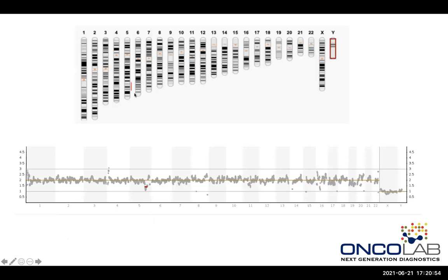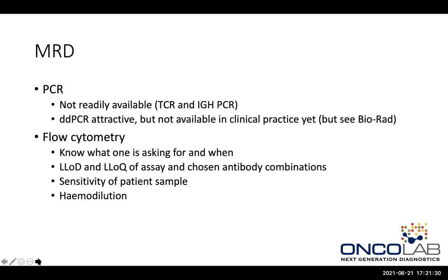So this was a patient we knew with an isolated 5q minus, and you can see that it picked that up successfully. But this patient had about, I think, 60% positivity on FISH, so it was easy to pick up. Had that patient had only a 5 or a 10% positivity, as you can see on this scatter plot at the bottom, it would have gotten lost in the background noise. So we've kind of abandoned this for the time being. It certainly is possible, but it needs a lot of changes to your bioinformatics, which I'm too stupid to do myself.